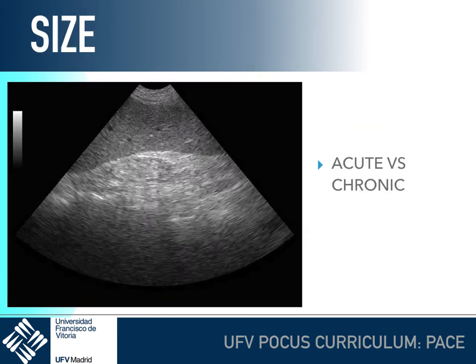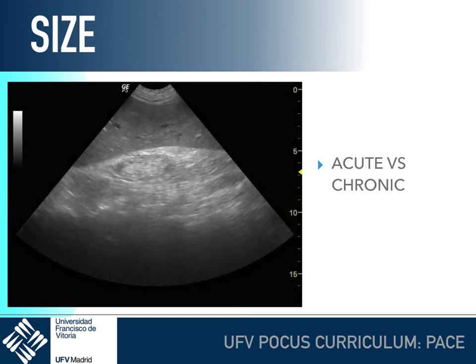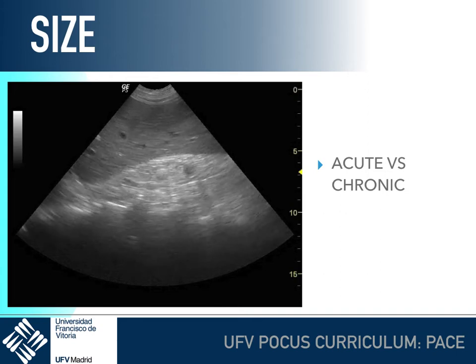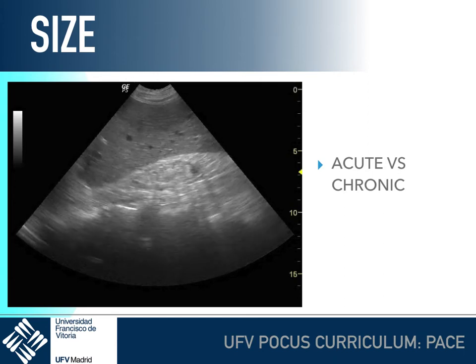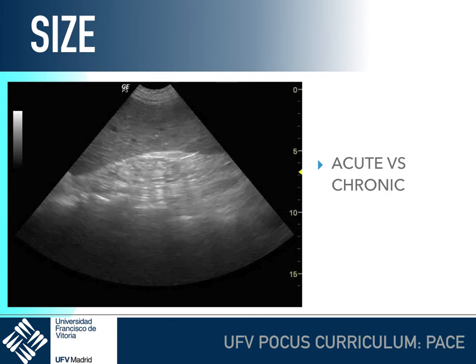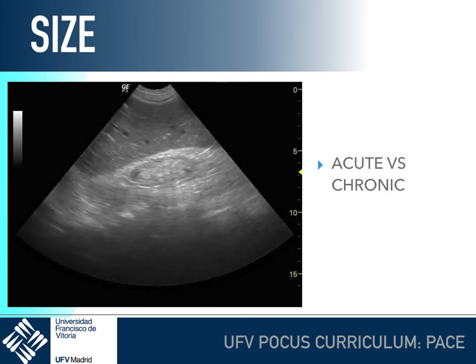We can assess the size as well. Like in this case, we are evaluating a really small kidney that can give us an idea of the course in terms of time of the condition. If the patient has something which is acute, or like in this case, is really chronic.